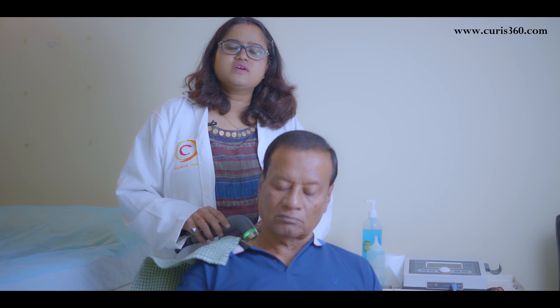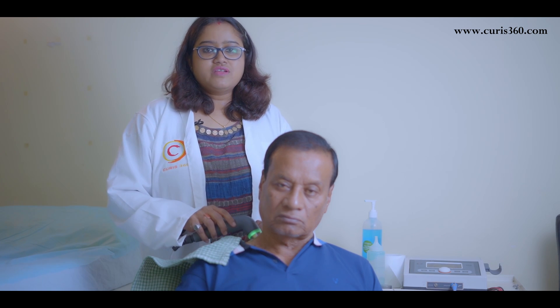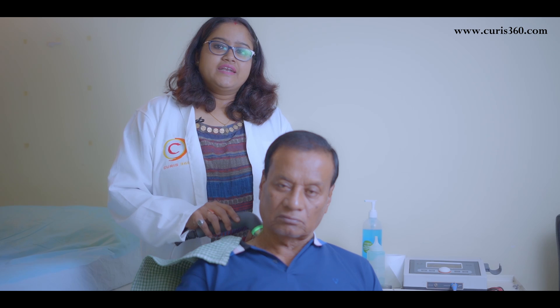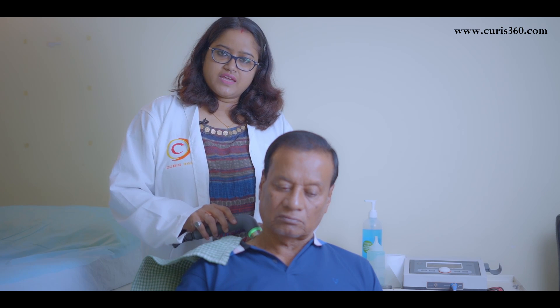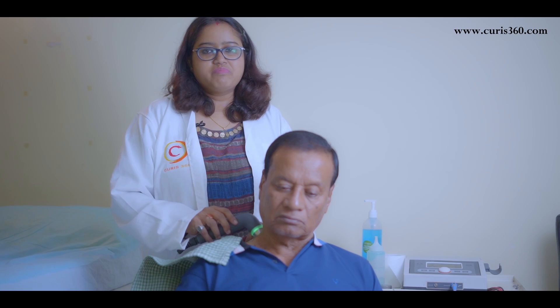This ultrasound can be used for various issues. Specifically, it is used for osteoarthritis, back pain, healing fractured areas, and reducing scar tissue. It also gives great benefit for neck pain, severe cervical issues, and muscle spasm.